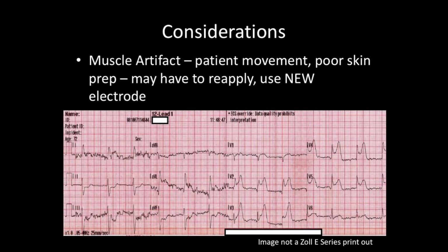Maybe a little bit in front, and then the thingy coming out in the back. You have to use your fantasy a little bit, but that is a term, fireman's hat. Not good, not good at all, right? Another term used is tombstones, but this looks to me more like a fireman's hat. Again, you're not required to know any of that. It's just additional knowledge.